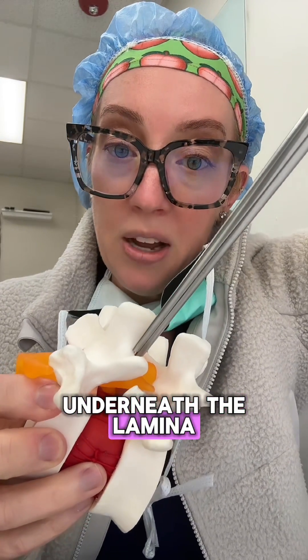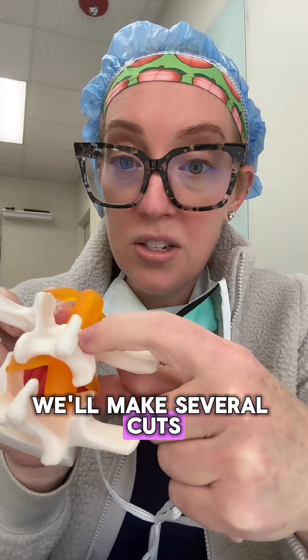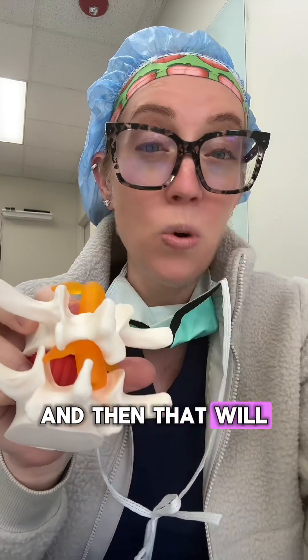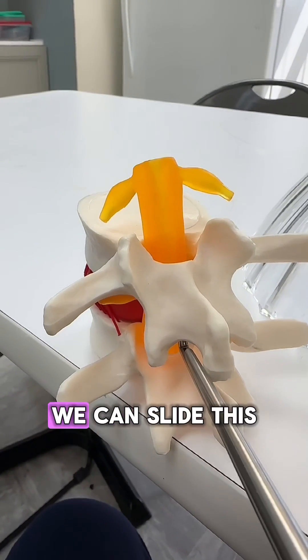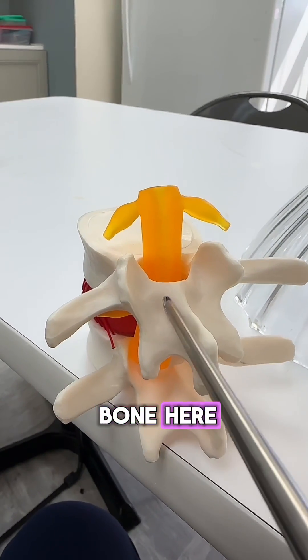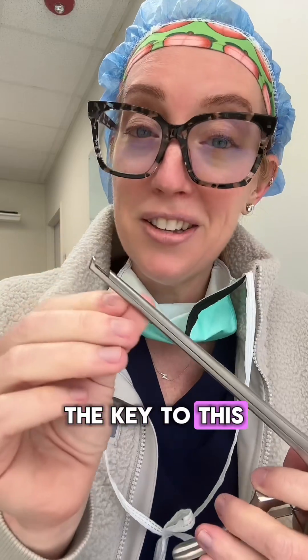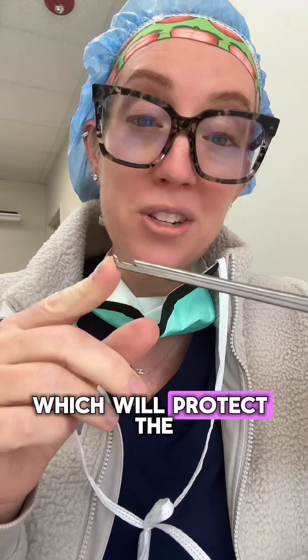To demonstrate, we slide the instrument up underneath the lamina and then squeeze it. When we do that, it makes several cuts across this part of the lamina and this part of the lamina, which allows us to remove the bone. During a laminectomy, we slide the instrument up under the lamina, squeeze the handle to cut the bone on both sides. The key to this instrument is that it is smooth on the back surface, which protects the nerves while we're performing the laminectomy.